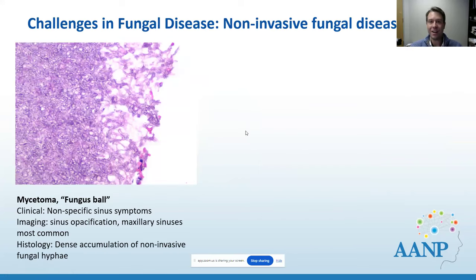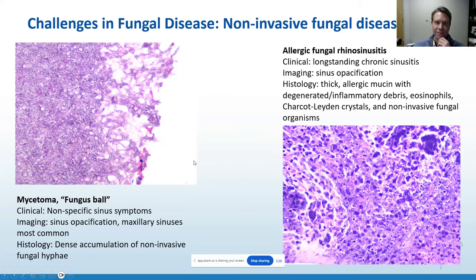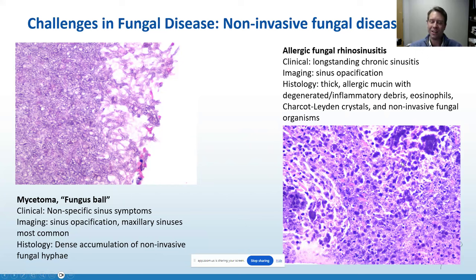Non-invasive fungal disease happens very commonly in the sinuses. You can have a mycetoma where fungus colonizes and presents with nonspecific symptoms — not fulminant like invasive fungal disease — and we see dense hyphae, in this case Aspergillus. We also have allergic fungal rhinosinusitis, which occurs in long-standing chronic sinusitis. These can look scary if you're not familiar because they have a grungy basophilic look, very thick mucin, and sometimes tigroid stripes — a good clue for allergic mucin — as well as Charcot-Leyden crystals, which can be helpful.